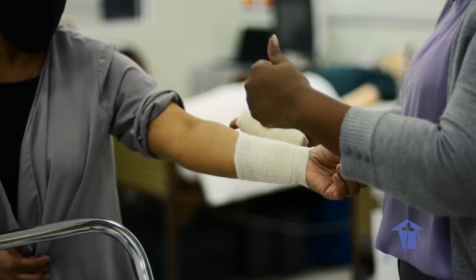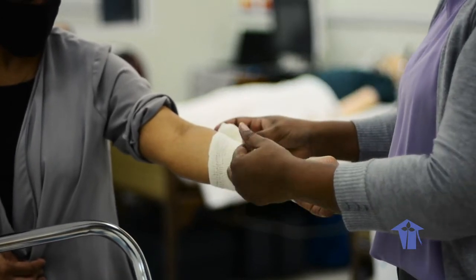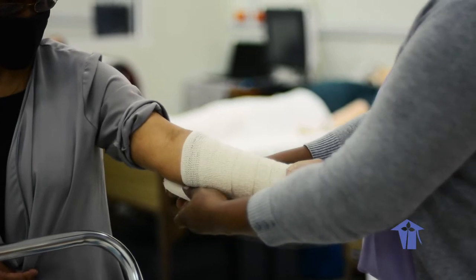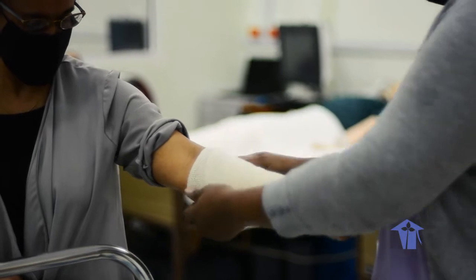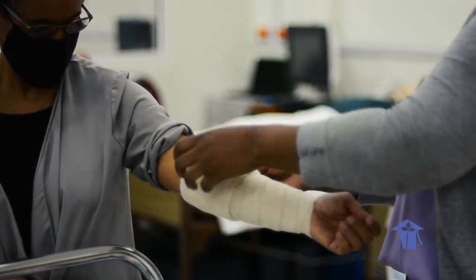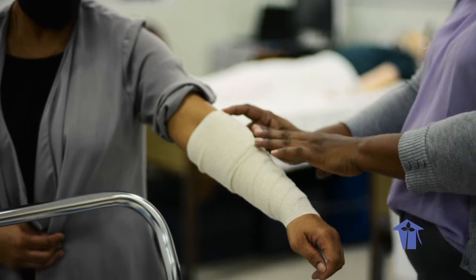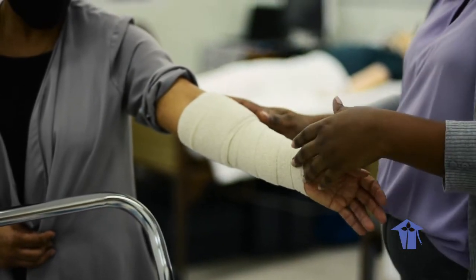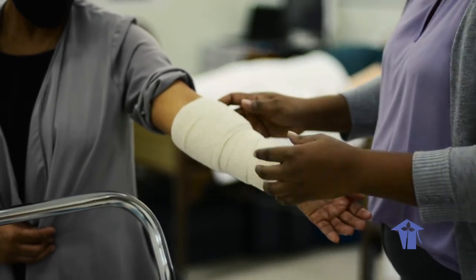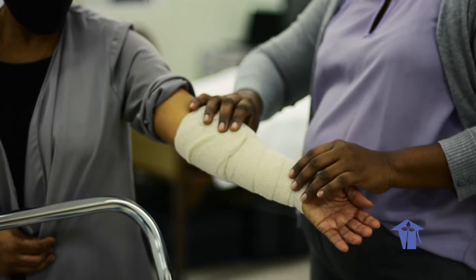For each consecutive fold, we cover two-thirds of the previous turn as we spiral up the limb. Checking in: Is it too tight? No, it's good. Continue rolling the bandage and then pin with a safety pin or secure with simple tape. This type of bandage is used when the patient has a wound on the arm. Be mindful that wherever the wound is, you don't want to secure the bandage end directly over it, as that puts unnecessary pressure on an area already sensitive to pain.